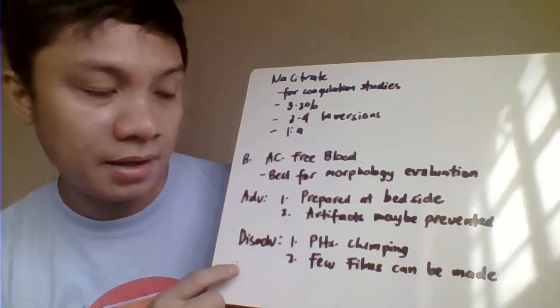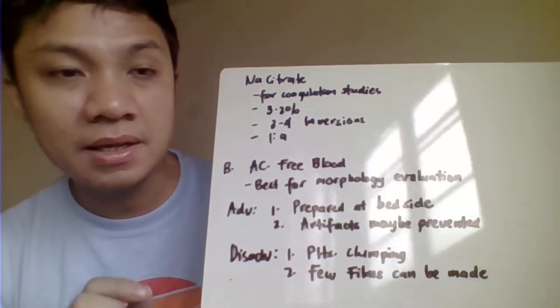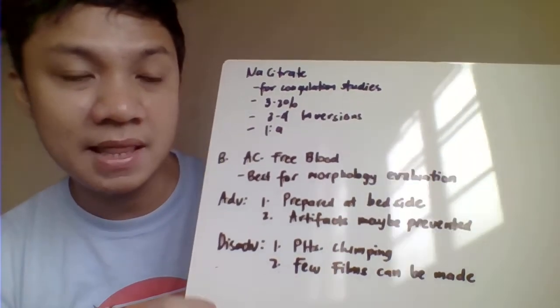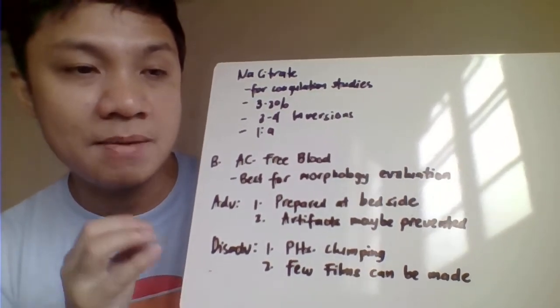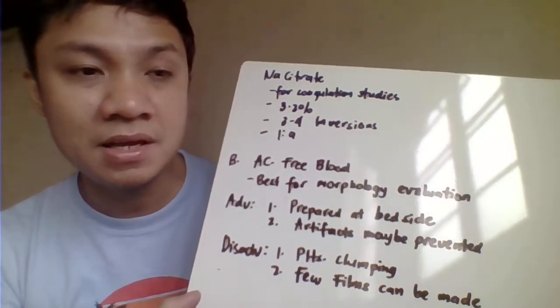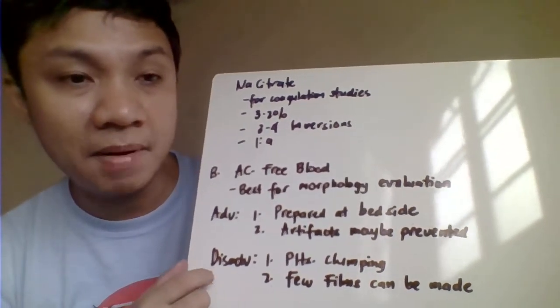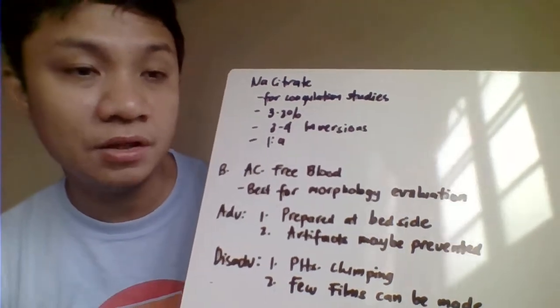Another one, you could also have platelet clumping, especially when the blood is not free flowing when you're collecting the blood sample from the finger of the patient. Like, if it's difficult to get blood from the patient, most likely you will squeeze and squeeze. Then upon transferring your blood collected from your capillary tube, it might already have clotted because of that. And therefore, it might induce platelet clumping in your blood film under the microscope.